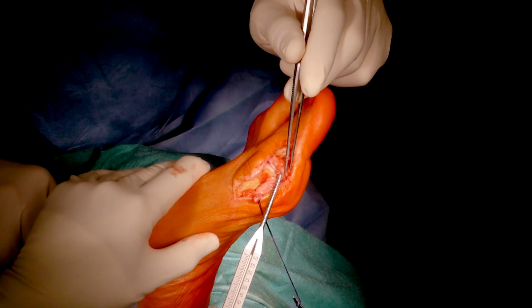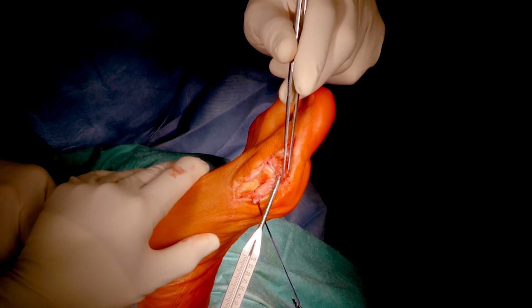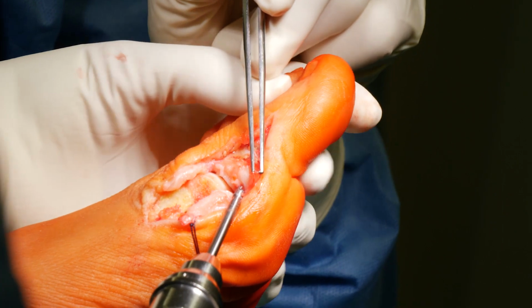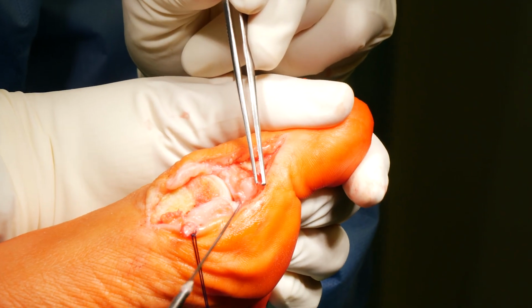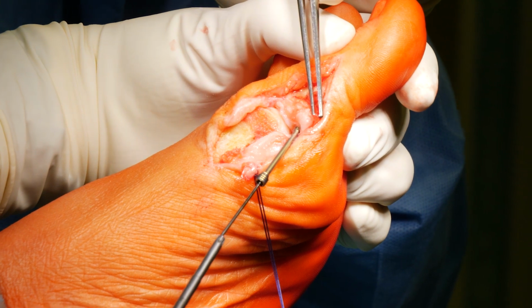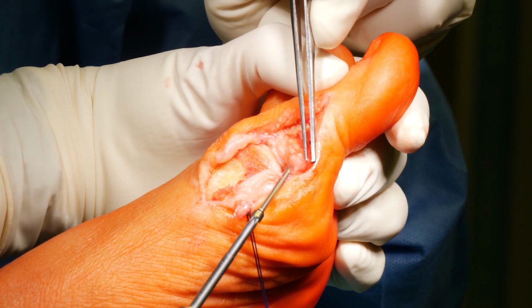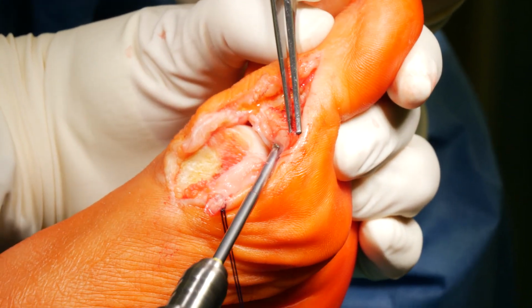The wedge is removed and the osteotomy fixed, in this case with a compression screw. Countersink is recommended to not crack the corticalis. The screw is slid over the K-wire and inserted by a screwdriver. Compression begins as soon as the head threads into the upper cortex.